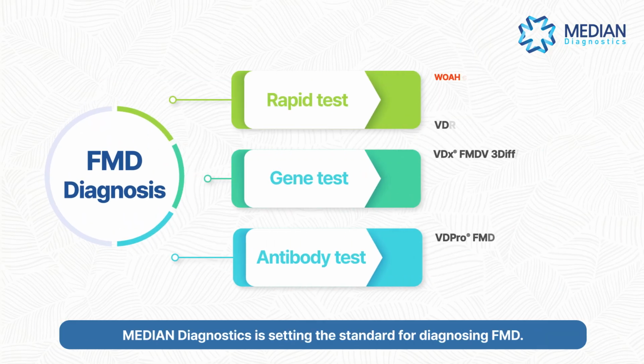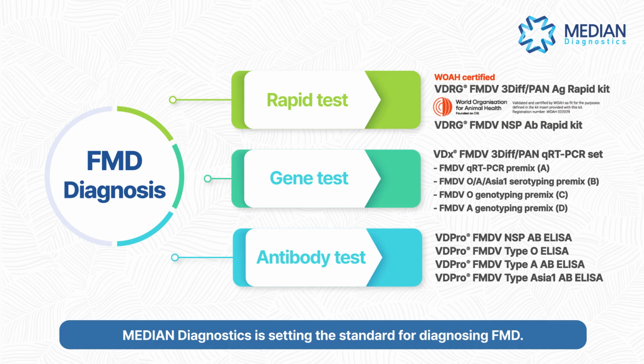Median Diagnostics is setting the standard for diagnosing foot and mouth disease.